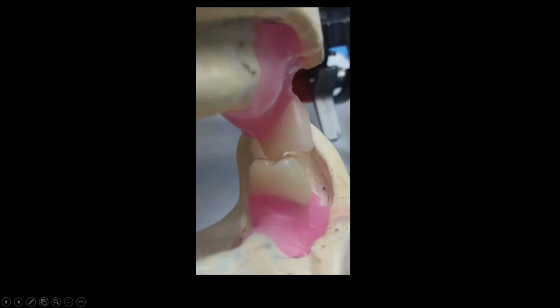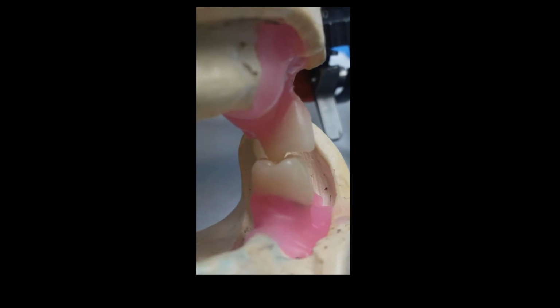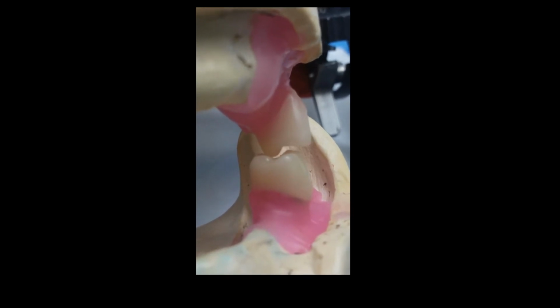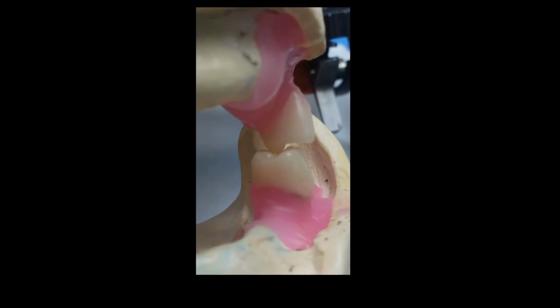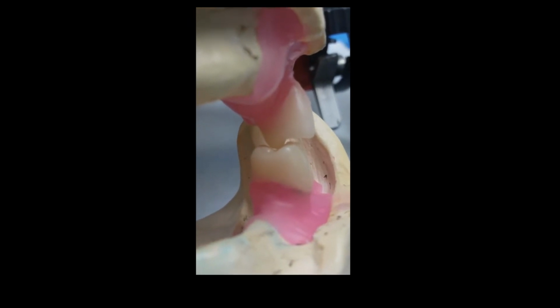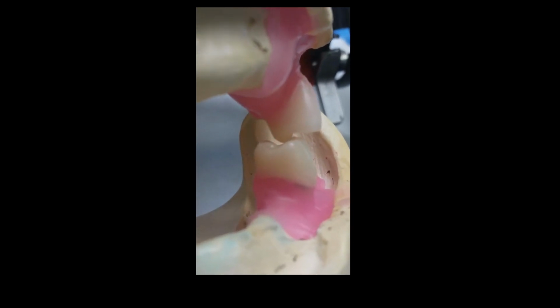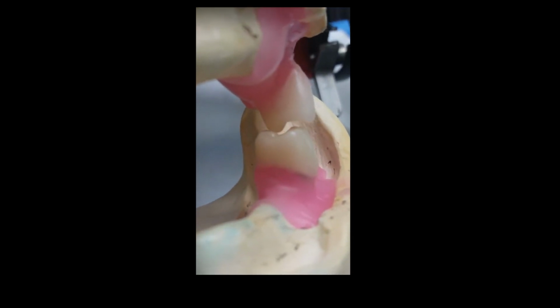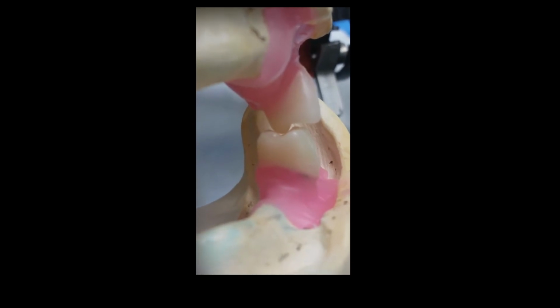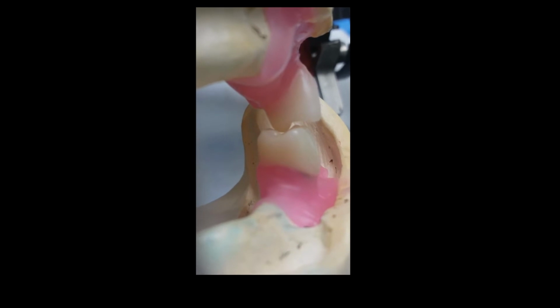And so what does that look like on an articulator? That's this. You can see that there's a little bit of wiggle in Centric, and now we do the standard working and balancing. I shifted the buccal cusp of the upper out of the way just to facilitate. You can see the lingual. And now there's a little bit of wiggle in there from, again, the freedom in Centric. It comes out of the factory with about 1 millimeter of wiggle, okay? 1 millimeter of freedom. There you go. That's kind of what it looks like on an articulator.